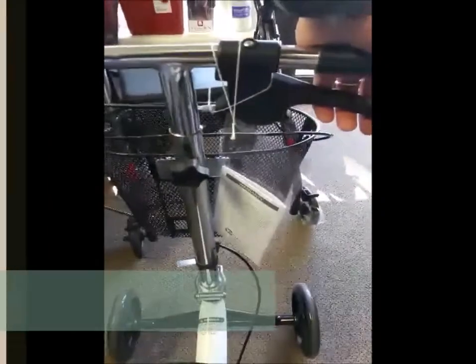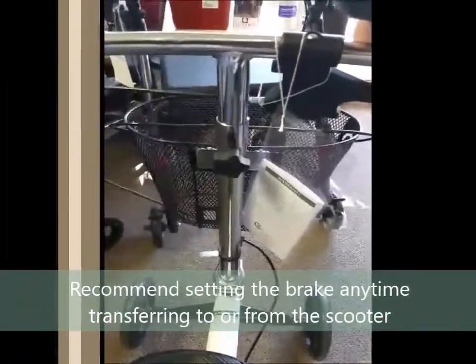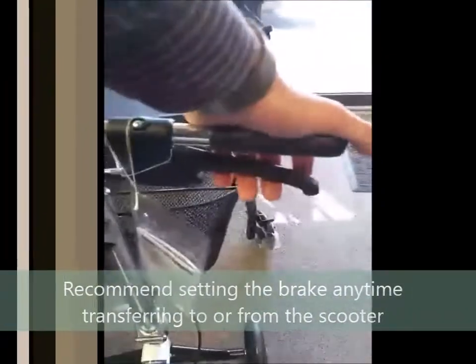You would use the brake lock in a parking lot — getting in and out of the car — so you don't have to chase the scooter down the parking lot. This releases the lock, and then you use the brakes normally when you're riding.